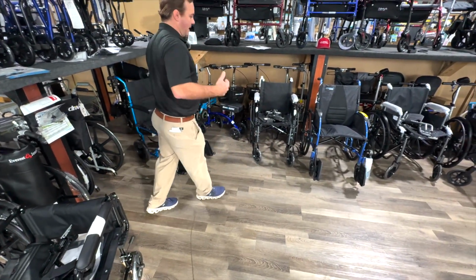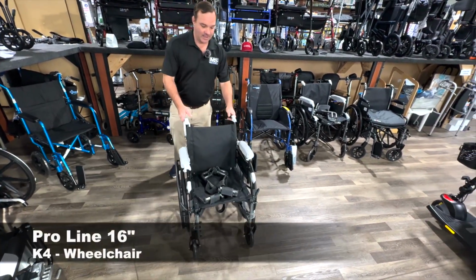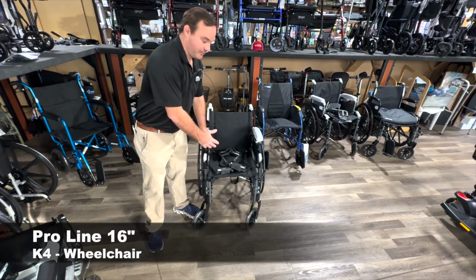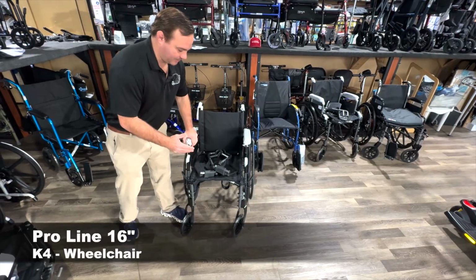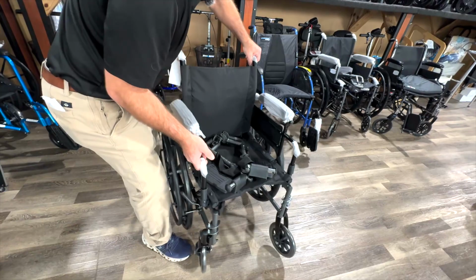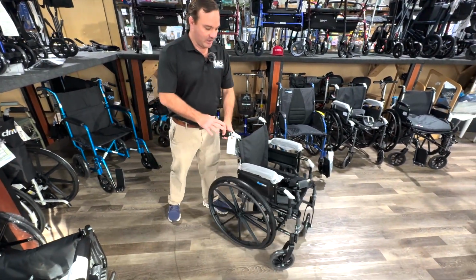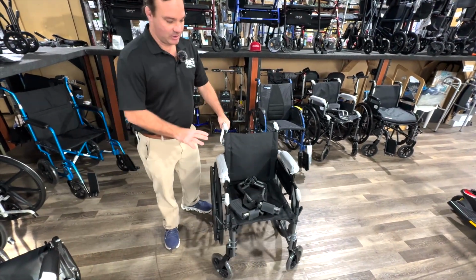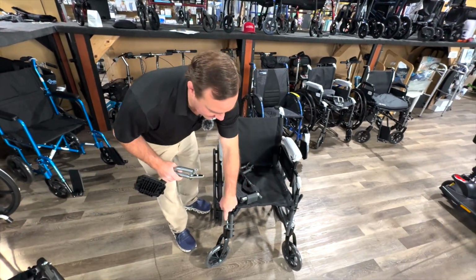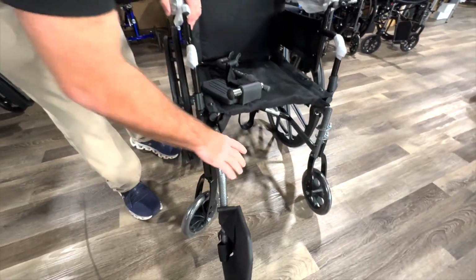Now let's get into what manual wheelchairs are. Right here is a new company we're dealing with, Proline. We're going to give them this 16-inch seat width. Now this is what they consider a lightweight wheelchair, and it's probably still about 30 pounds, I would say. But what's cool about this chair compared to all this is there's a little bit of adjustments. For example, you can get elevated leg rests. So these are your standard leg rests, what we call swing-aways.